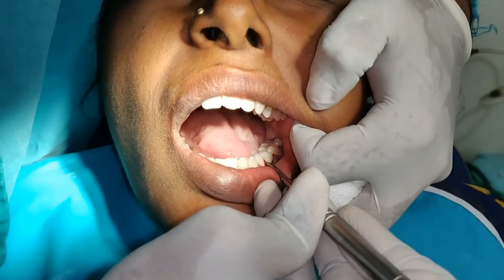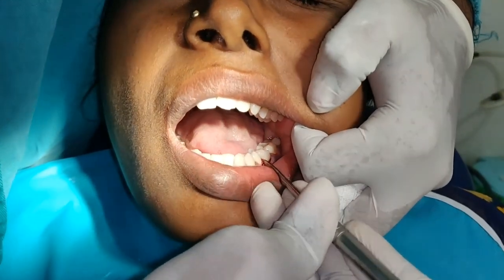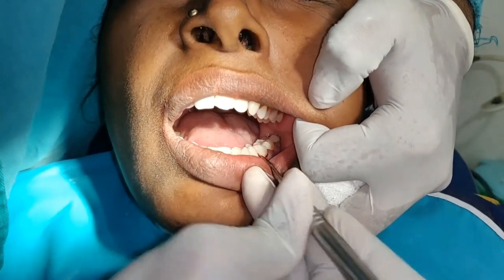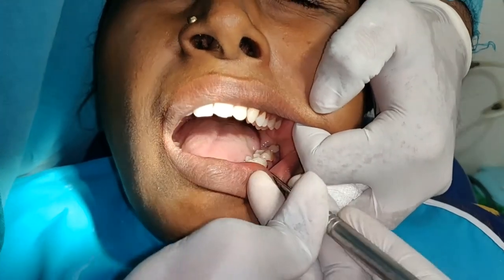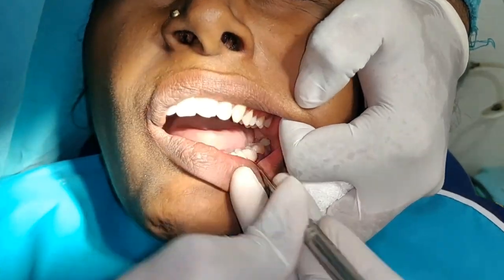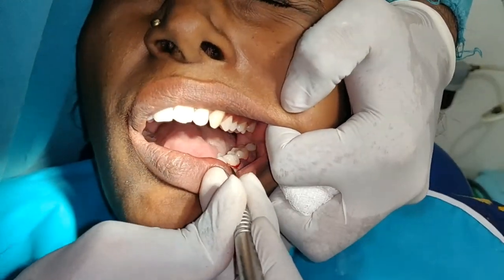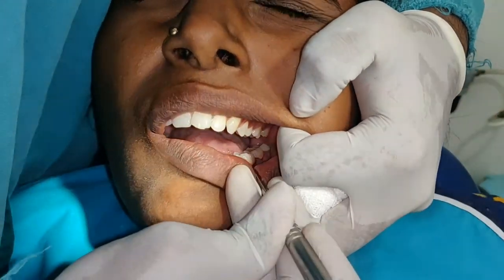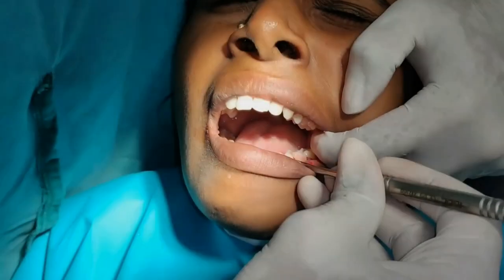Hello all. Today we are extracting a grossly decayed tooth number 36 due to a long-standing dental infection called periapical cyst, also known as radicular cyst.